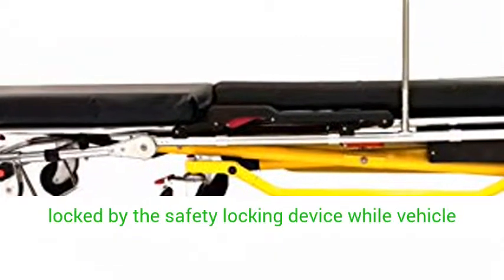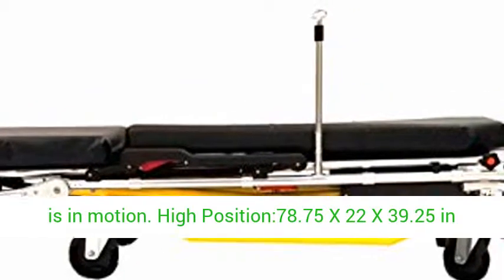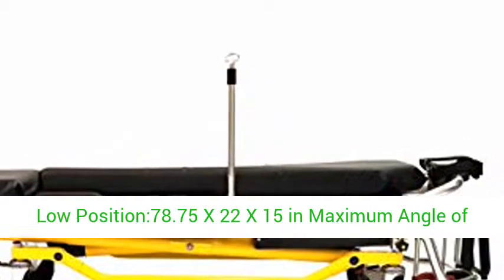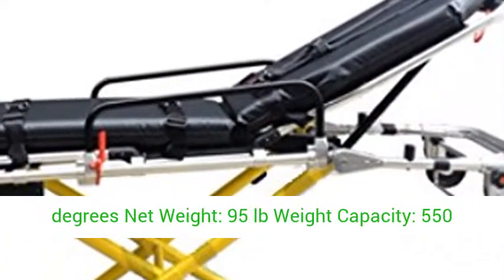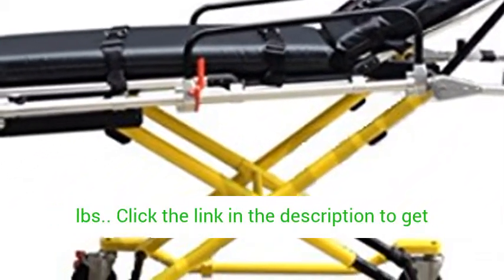High position: 78.75 x 22 x 39.25 inches. Low position: 78.75 x 22 x 15 inches. Maximum angle of backrest: 75 degrees. Maximum angle of legrest: 35 degrees. Net weight: 95 pounds. Weight capacity: 550 pounds.